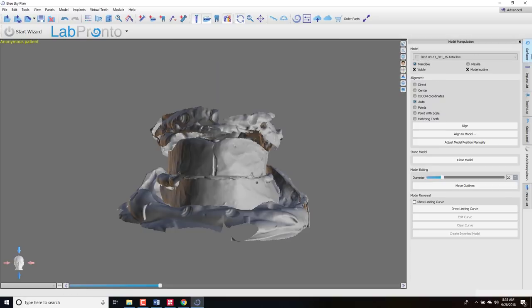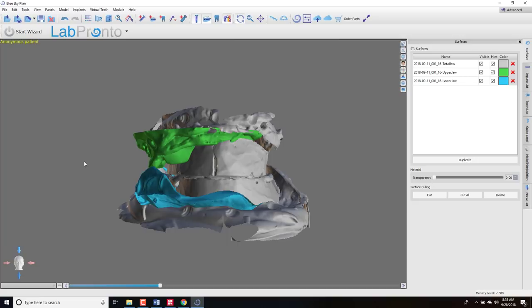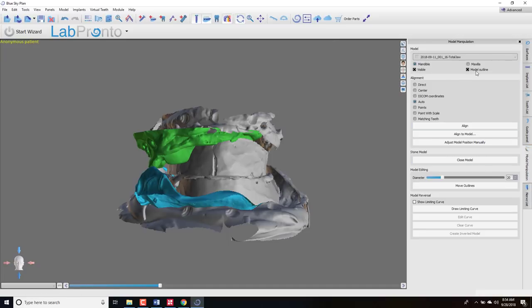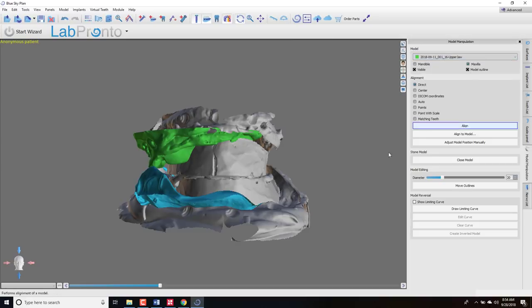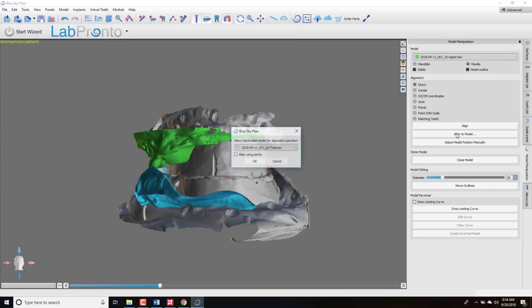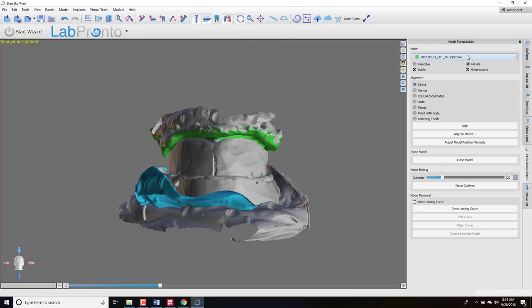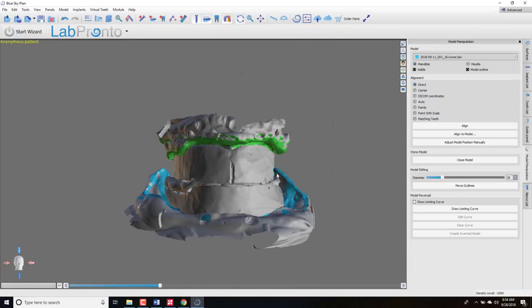Now the other models are not oriented — they're still oriented the other way. When you save an STL it's not just saving the shape; it's also saving its XYZ coordinates in space, so the software remembers the original orientation of these models to one another. If you've changed just one and want to bring the others back into relationship, click Direct. Choose the maxillary model in the dropdown, select Direct, then Align to Model, and set the destination model to the total jaw. Click OK and it pulls into position. Repeat the process with the mandible to get all models in the right orientation.